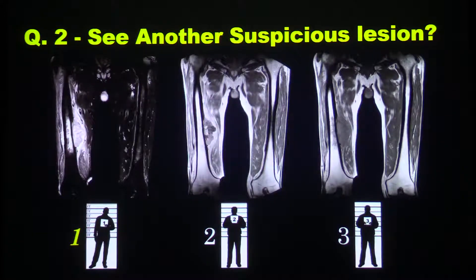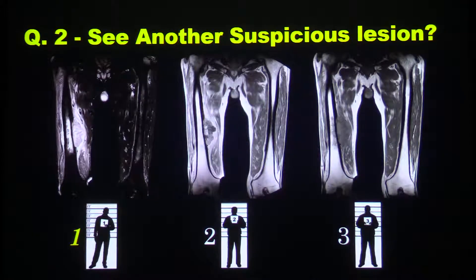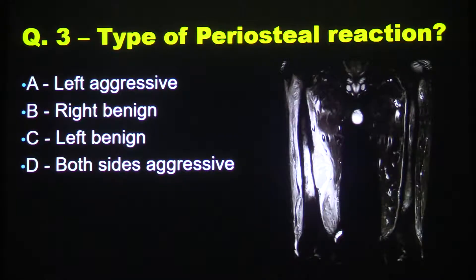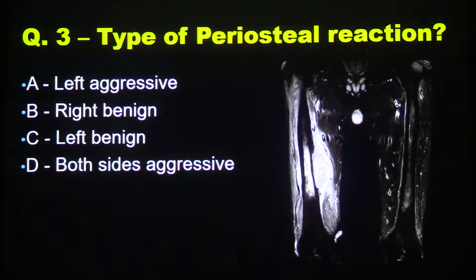What we see on the other side — on the left thigh — is a periosteal reaction, a very wide periosteal reaction along the entire bone, which is actually suspicious. Why should he have a periosteal reaction on the other side of the lesion if it's a primary lesion? Here is the periosteal reaction.